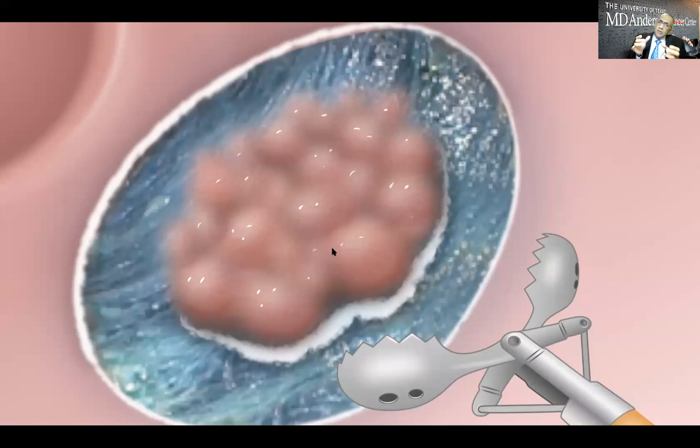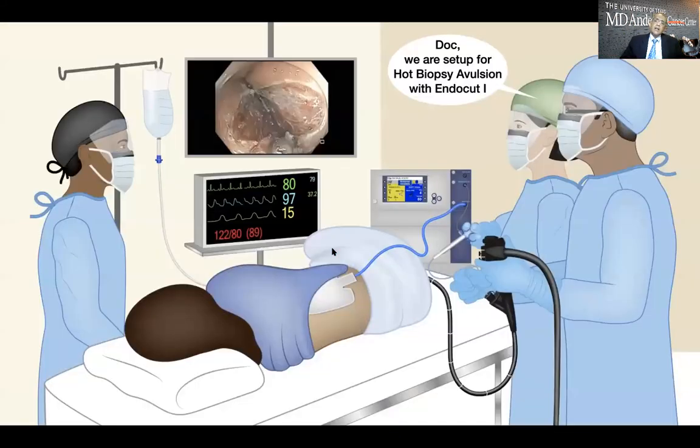And when it comes to tethered polyp resection, I use a hot biopsy avulsion technique that will require changing of your electrosurgery parameter from endocut Q to endocut I. And I typically use effect 1. There is no coagulation. As you know, effect 1 has no coagulation in between the cuts. And I increase the duration to either 2 or 3. There's no magic to this. And keep the interval around 1 or 2.